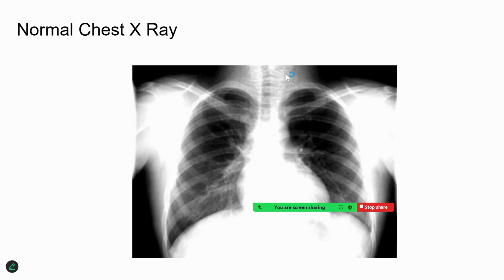If you have to read the X-ray, the first thing is you have to see whether the image is properly qualified or not. When I say qualification of the image, it also depends upon the position in which the X-ray is taken and the other technical aspects. The position in which the X-ray is taken also depends upon the indications, the purpose of going for the X-ray.